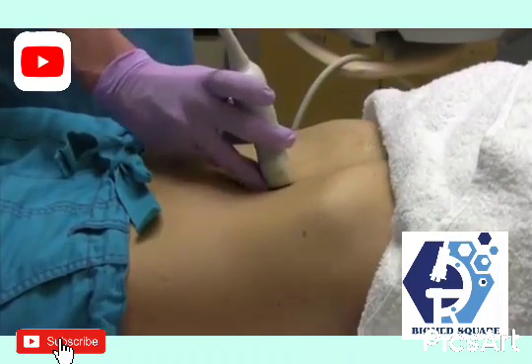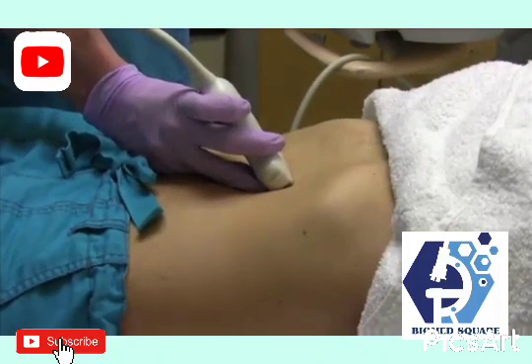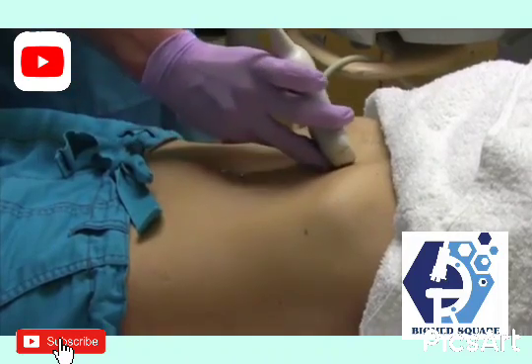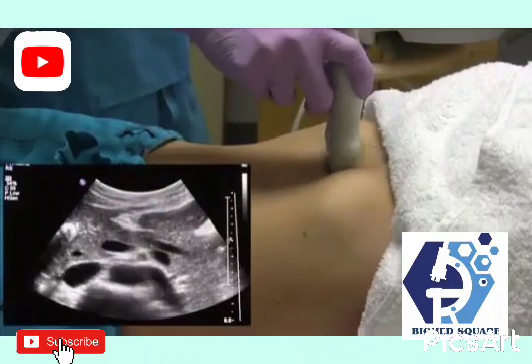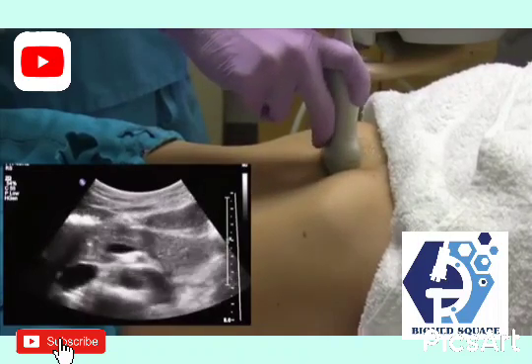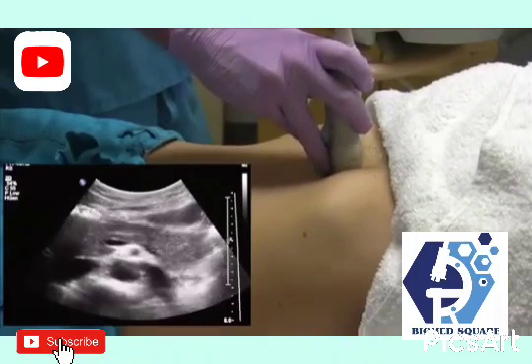Instead of coming down low and angling up, you're going to use bowel, which is never a good scan window in ultrasound. So we're going to come up high, angle down, and the other key is you want to oblique your transducer slightly counterclockwise. This will set you up for a nice sagittal pancreas image.